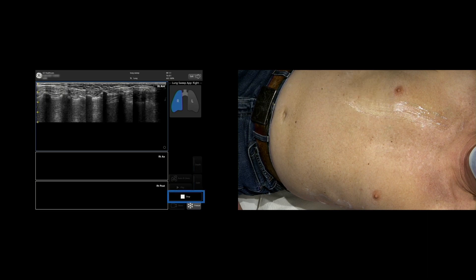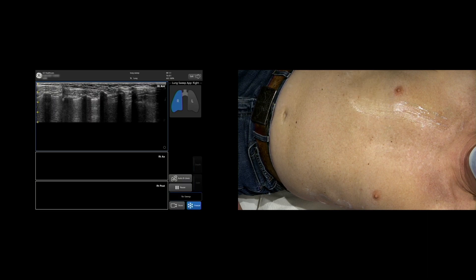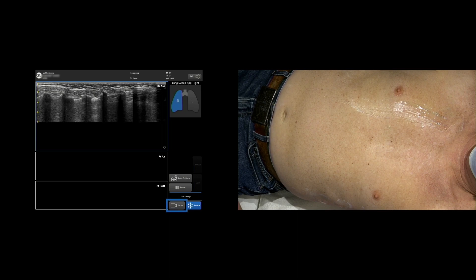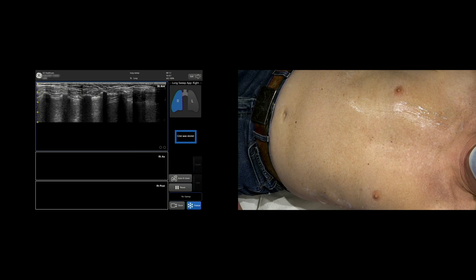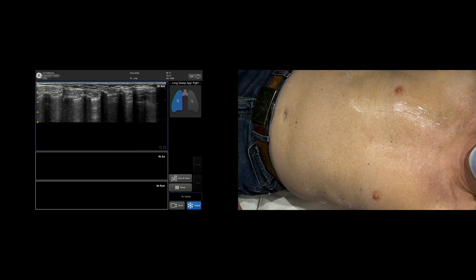Lift the probe to complete the sweep or tap Stop. Before performing the next sweep, tap Store. When the video is successfully stored, the following message will be displayed: 'Cine was stored.'